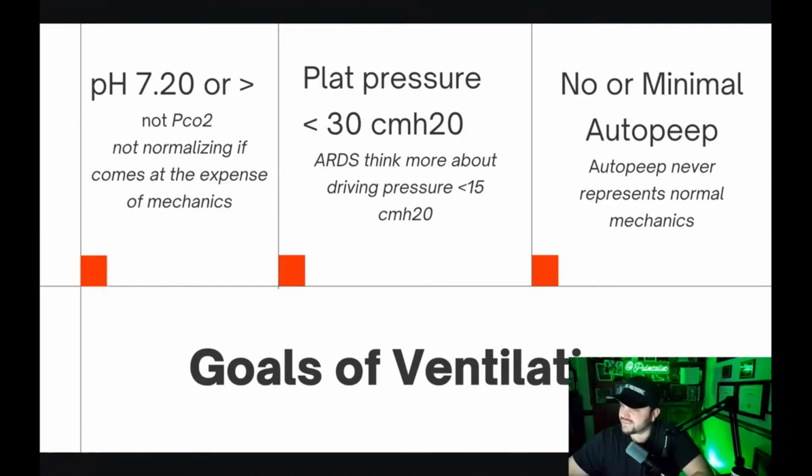And I've seen a lot of harm done with people trying to get to normal or as close to normal as possible, cause auto PEEP, and then maybe the gas is a little bit worse because auto PEEP by definition creates more dead space. So then they increase the rate more, and then you have more dead space, and you're not ventilating as well, and then you're getting more and more auto PEEP. And so it can fall off the rails very easily.